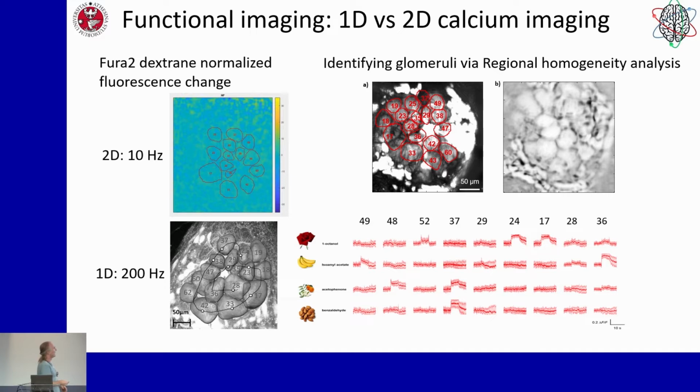Now, if we want to do functional imaging, we use a calcium sensor that detects neural activation in the neurons, but in honeybees we cannot just genetically express this, because transgenic bees do not exist yet. So we have to manually insert this sensor by a very small capillary with micrometer size, hitting the axons of the neurons that we are interested in.